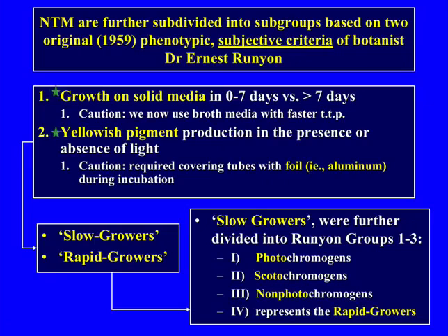And he was going to determine if yellowish pigments were produced in the absence of light under the foil or in the presence of light, or both. If we go that route in 2019 to identify a Mycobacterium, I would be sued, because that is extremely slow.